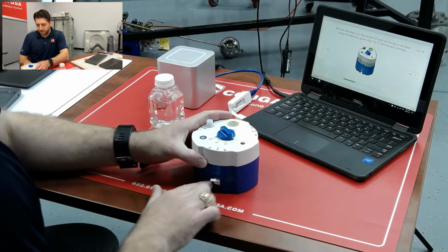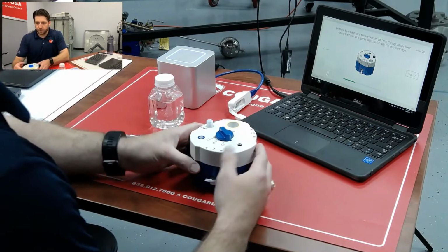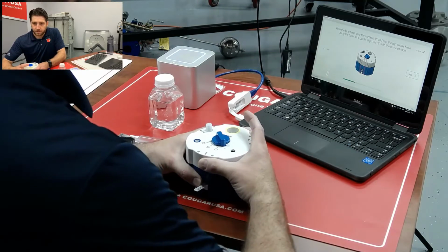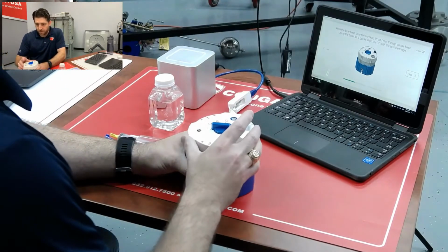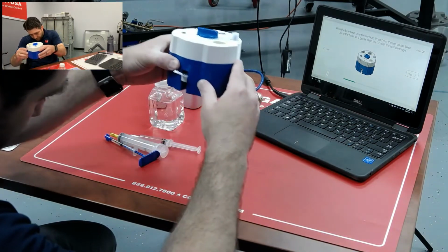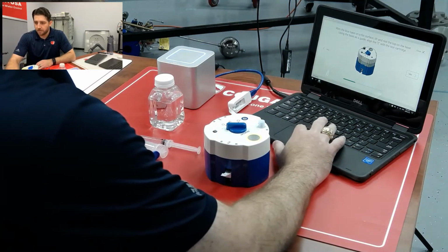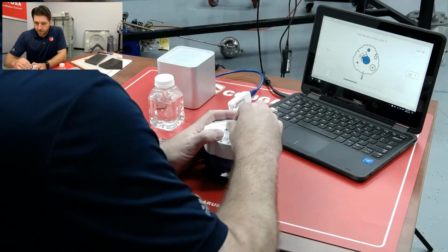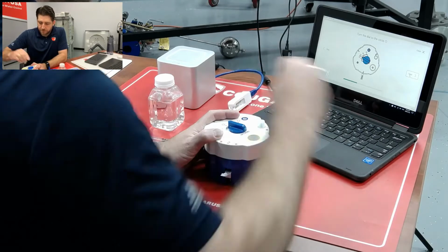This is the vial actually where the sample is going to end up that we will put into the cube. First we're going to prep it and follow along with our instructions here. So we're going to be moving this to the tube and check for crushed beads. Yes, we crushed the beads inside our little vial. And now rotating this to the circle for the first step there.